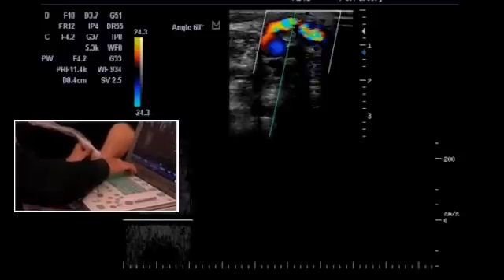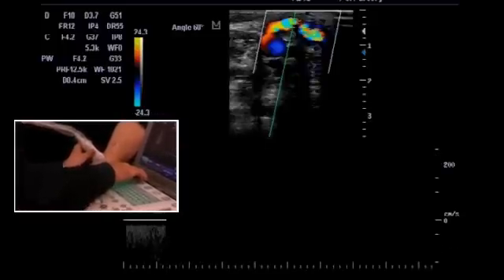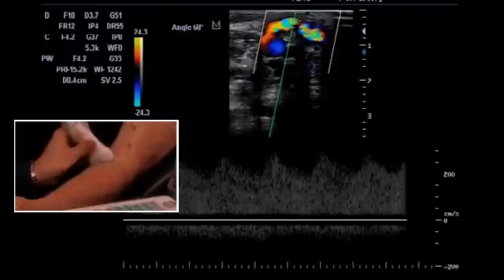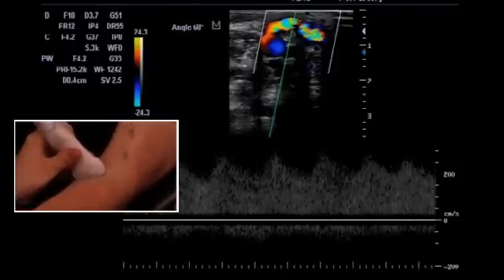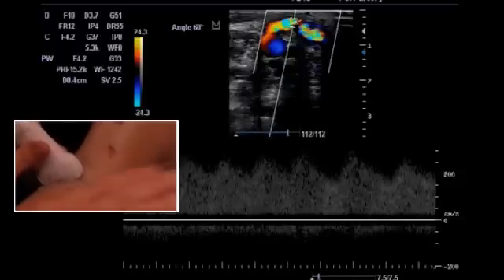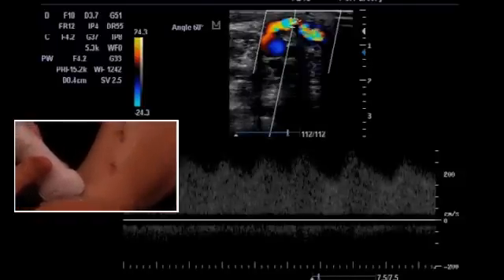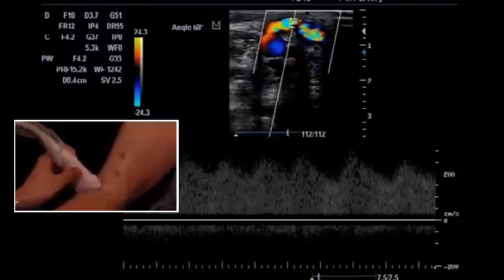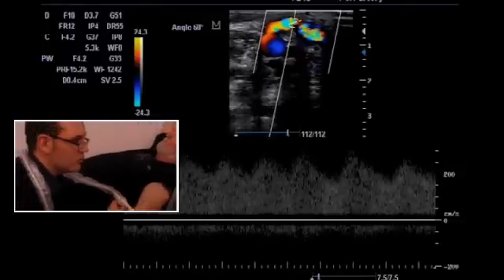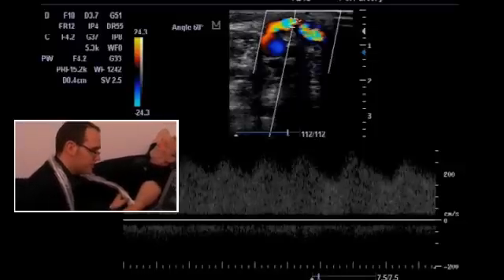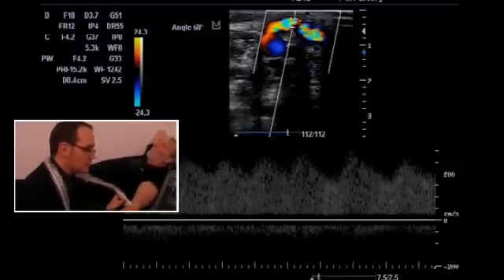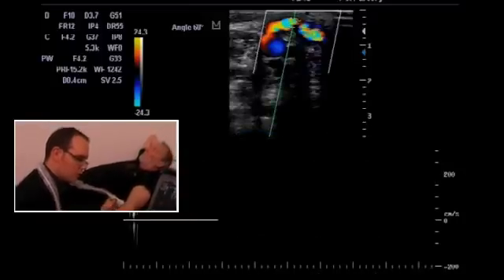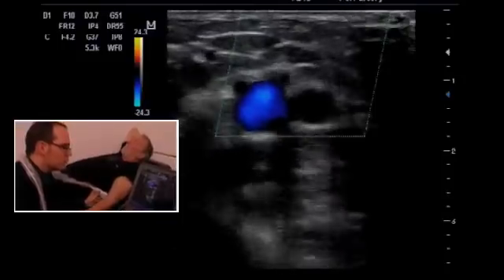The third way of diagnosing the stenosis is with pulsed-wave Doppler, where you can find very high flow velocities. In this case we see a peak velocity above 2 meters per second. Normally a high-grade stenosis is defined by a 2 to 3-fold increase of blood flow velocity compared to an unaffected segment. We can, for example, measure the flow velocity just proximal to it.